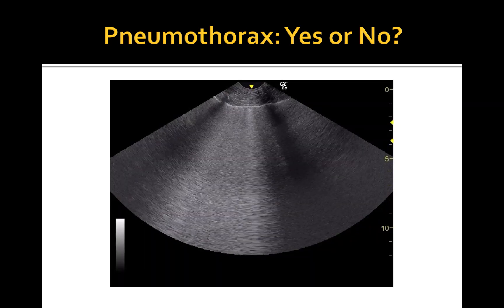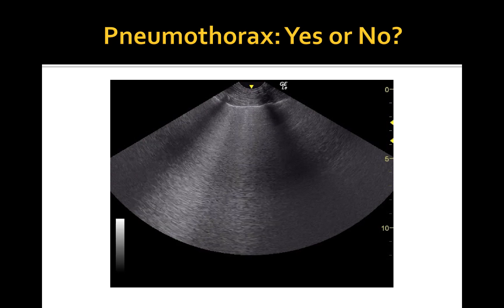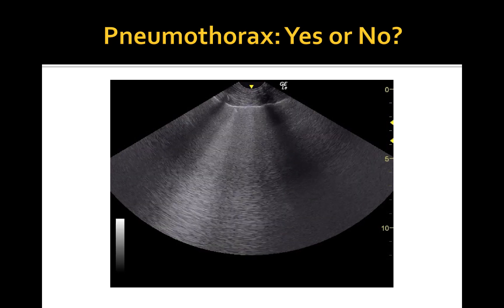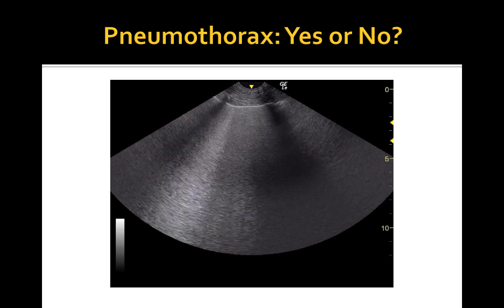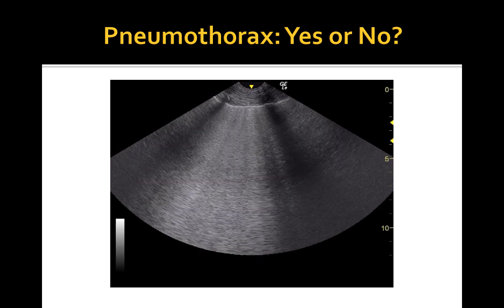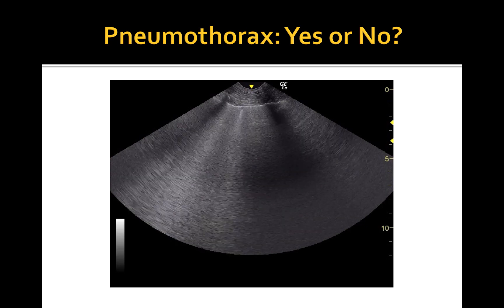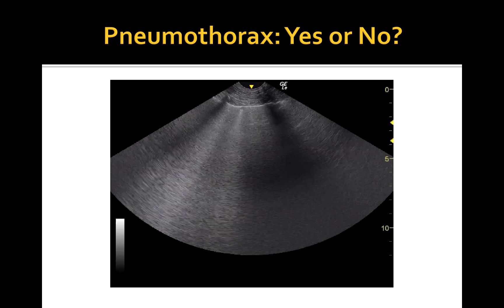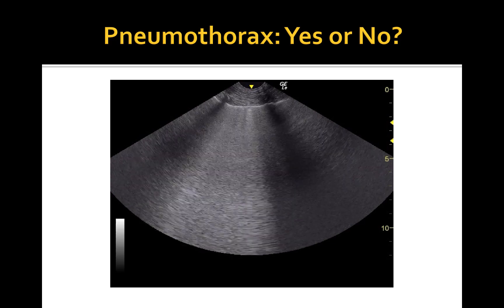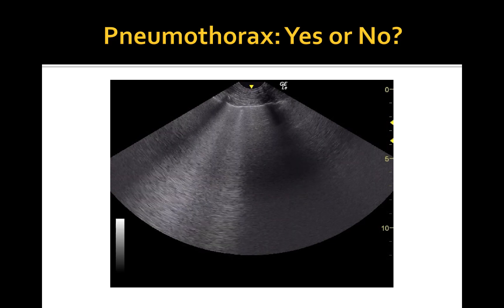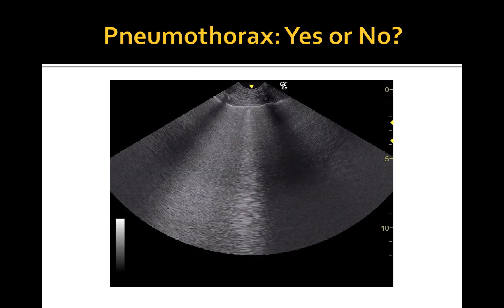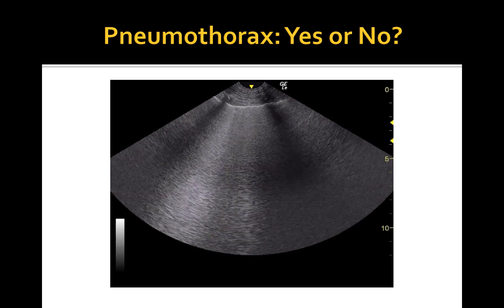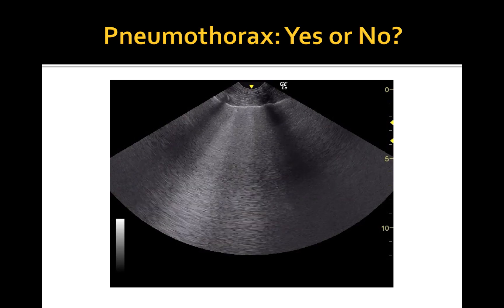In this case you can appreciate multiple ring-down artifacts or B-lines that effectively rule out the presence of pneumothorax, because in order to see them the ultrasound beam should be able to reach the visceral pleura, which may occur only in the absence of pneumothorax or air blocking the ultrasound beam.